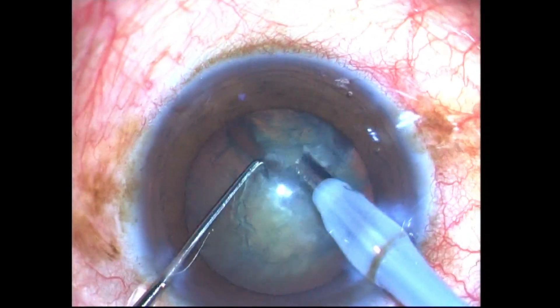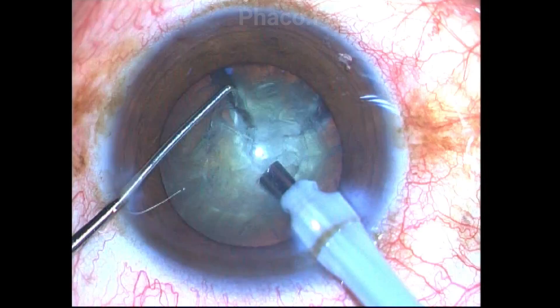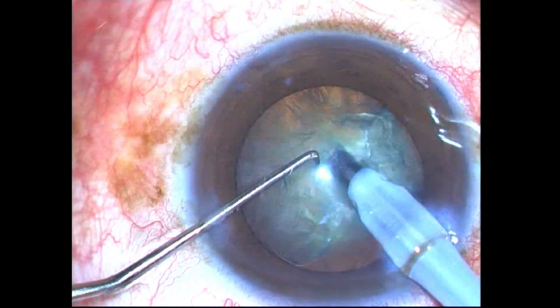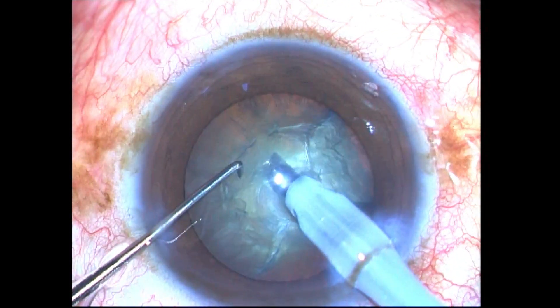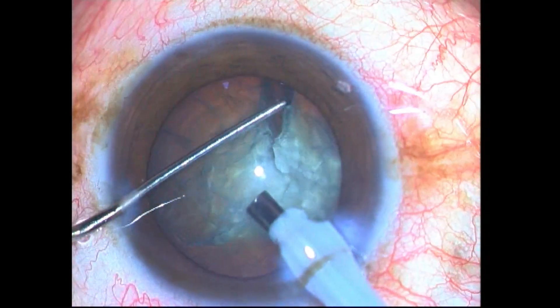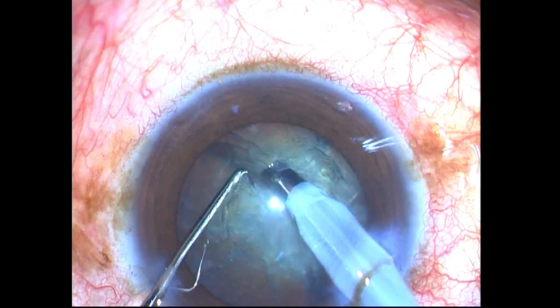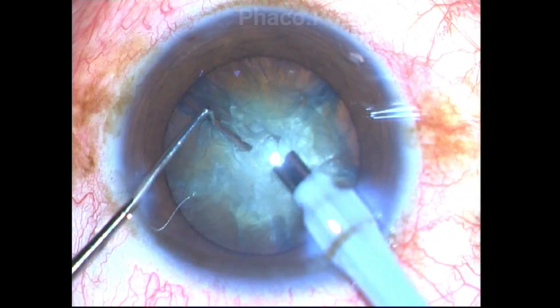In my next attempt, I bury the facotip a little deeper — about 1.5 to 2 millimeters — staying within the central area just inside the capsulorrhexis. This time I am able to get a clean chop through and through the nucleus. You should not take the tip towards the periphery beyond the nucleus sclerotic area, as the periphery is soft and you may create a buttonhole in the peripheral soft cortex and inadvertently hit the posterior capsule.